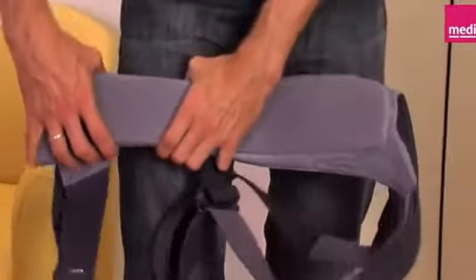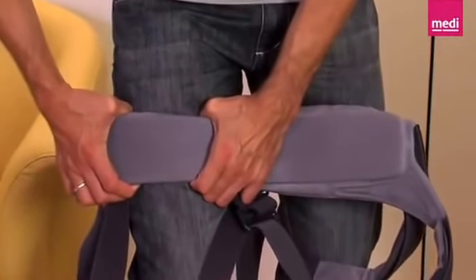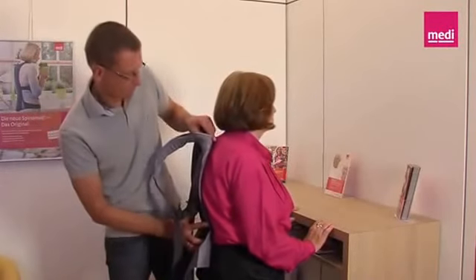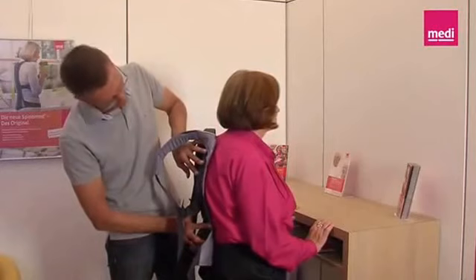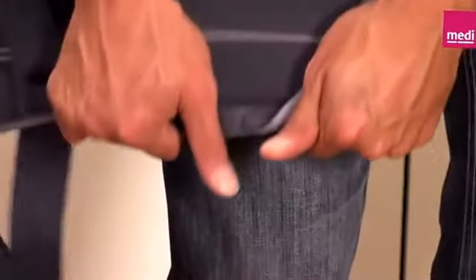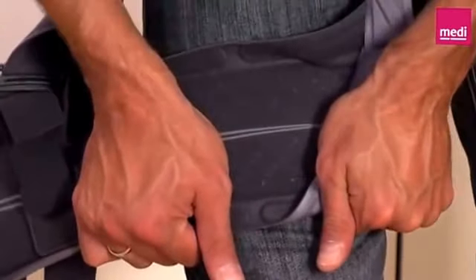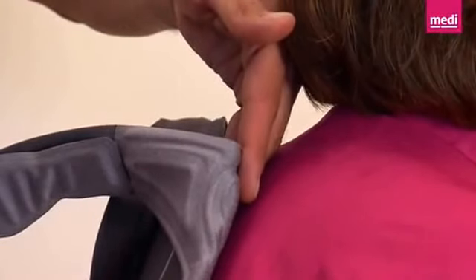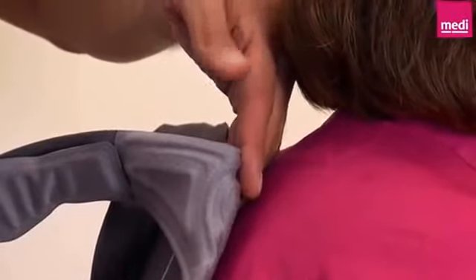Setting the back rod. Now the brace will be set, starting in the lumbar area. The brace is set from bottom to top, following the curvature of the back. As you can see, setting can be carried out without any tools. It's important that you always apply the splint to the marking point to check that everything is aligned. Now set the splint step by step in the direction of C7 until it traces the entire spine. To allow the patient to stand up straight with the brace, a small gap of about three fingers' width should be kept free between the splint and the body at the upper edge of the brace.